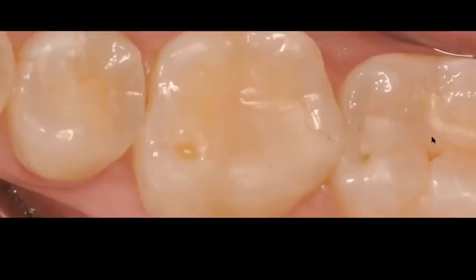You have something that is called a stress buildup, and I'll talk a little bit about that in a couple of minutes. But just to give you an idea, when you're light curing your restoration, you're going to have some stress building up during that polymerization phase, and that stress can affect your restoration negatively. So I see that a lot when you do horizontal layering techniques.